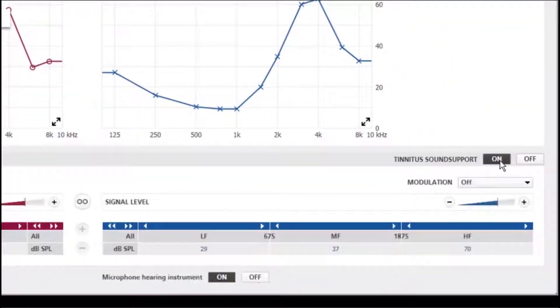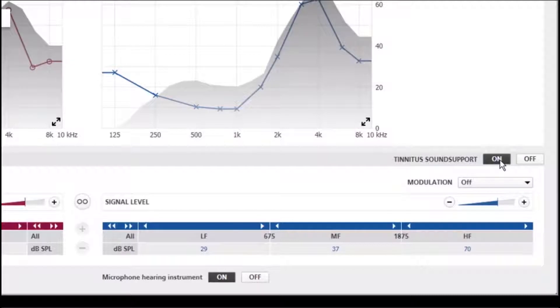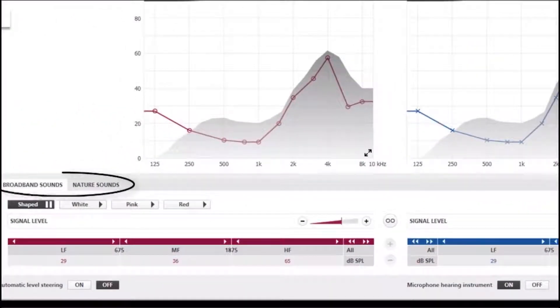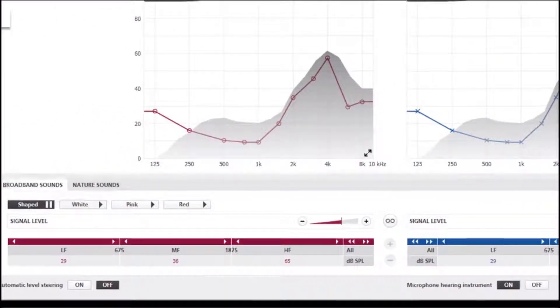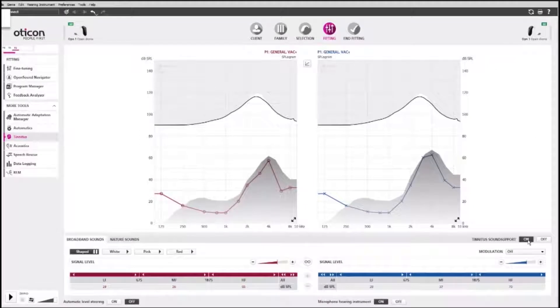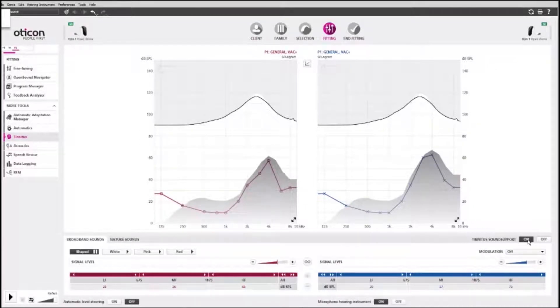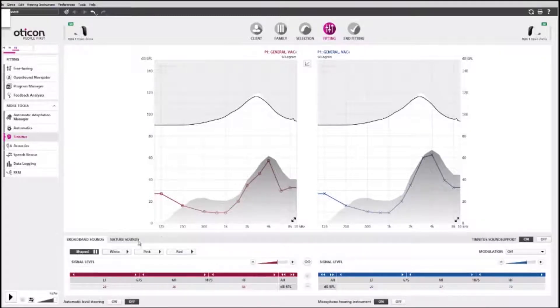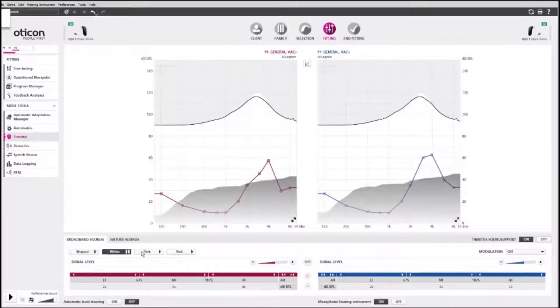Turn Tinnitus Sound Support on. The tool offers broadband relief sounds and nature-like relief sounds. The default relief sound is a broadband sound shaped to the client's audiogram. You can also choose white, pink, or red broadband sounds.